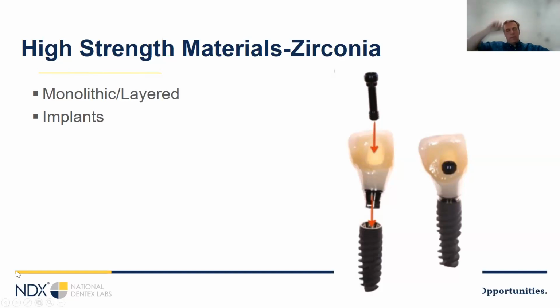One other little trick that maybe a lot of people haven't heard of is a screw-mentable crown. A screw-mentable crown is a normal cement retained looking abutment and then a crown with a screw hole in it. So what you do is you seat the abutment by hand, take your film, make sure it's good, seat the crown, cement them together, and then you can remove the whole thing as a unit to clean out the sulcus. So you get the easier contacts of a cement retain and the hygiene advantages of a screw retain. If you want to do that, make sure that you explain to your laboratory what you want by screw-mentable, because for whatever reason, I've seen a variety of different definitions of that.